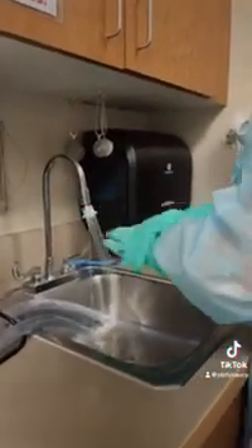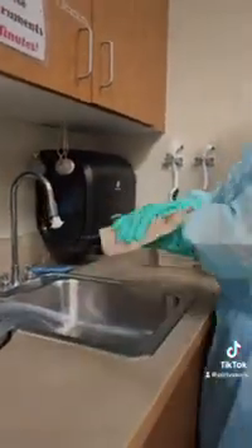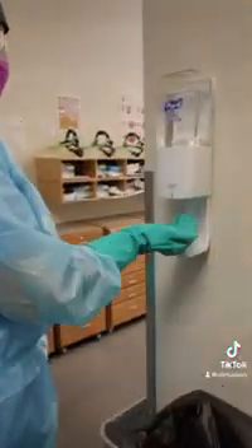After all the steps have been completed, we are now going to wash the utility gloves under running water with soap, and then we are going to disinfect the utility gloves with alcohol-based hand sanitizer.